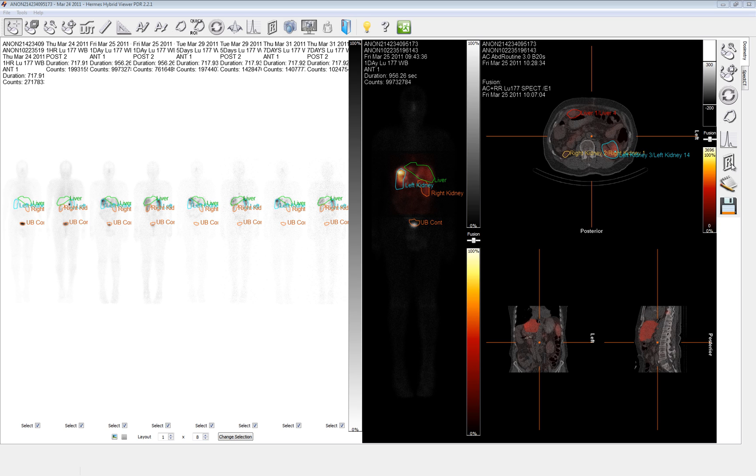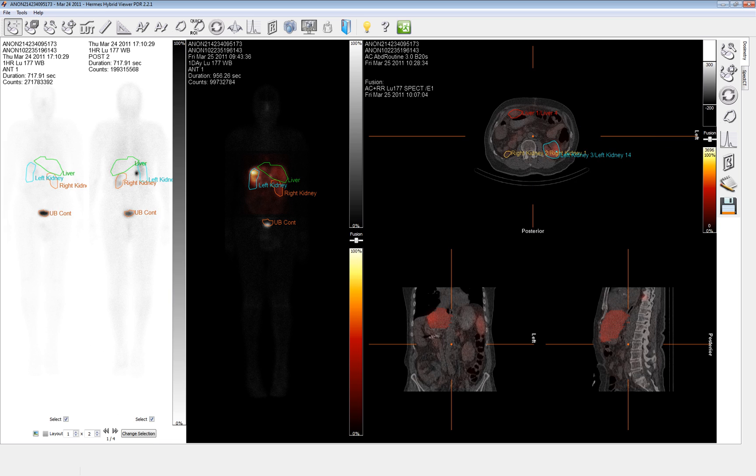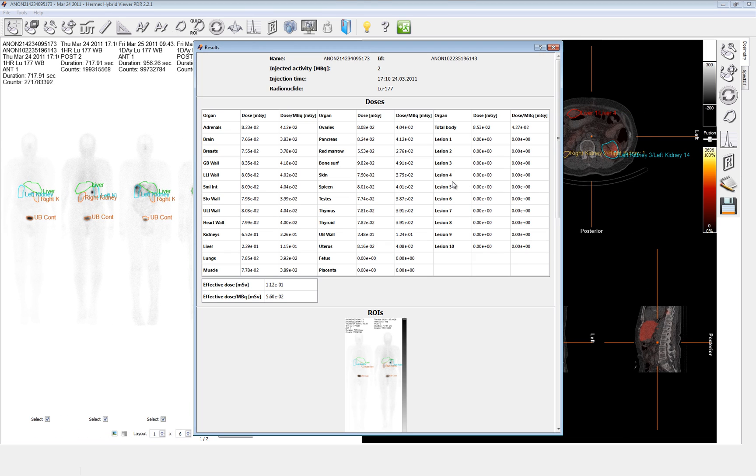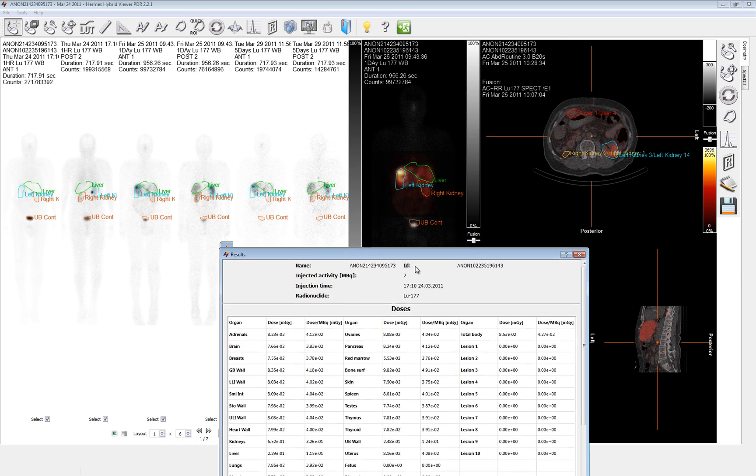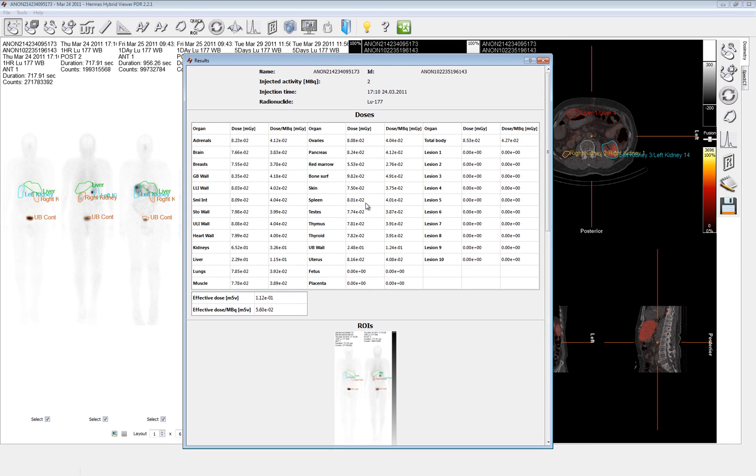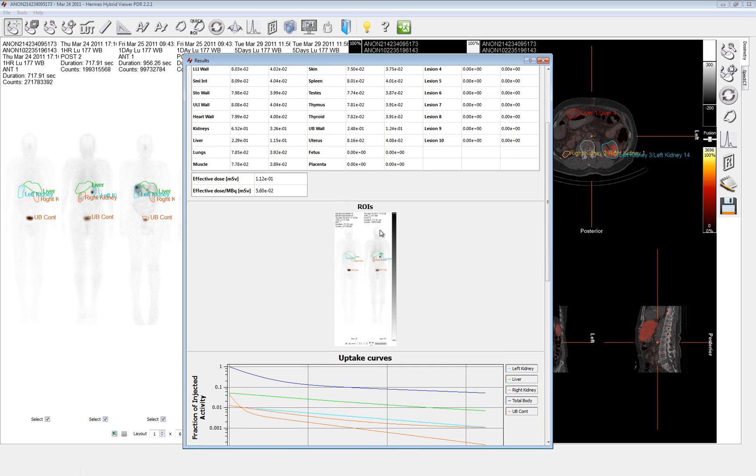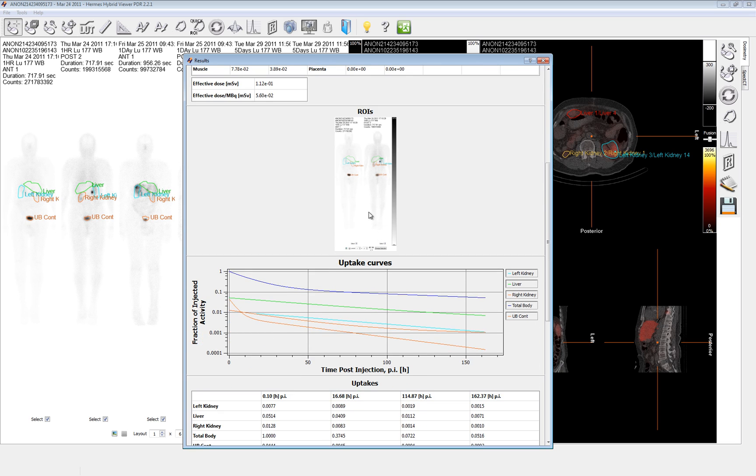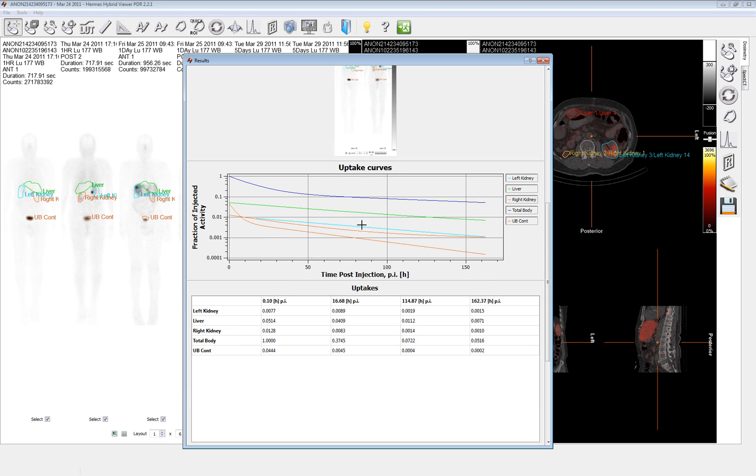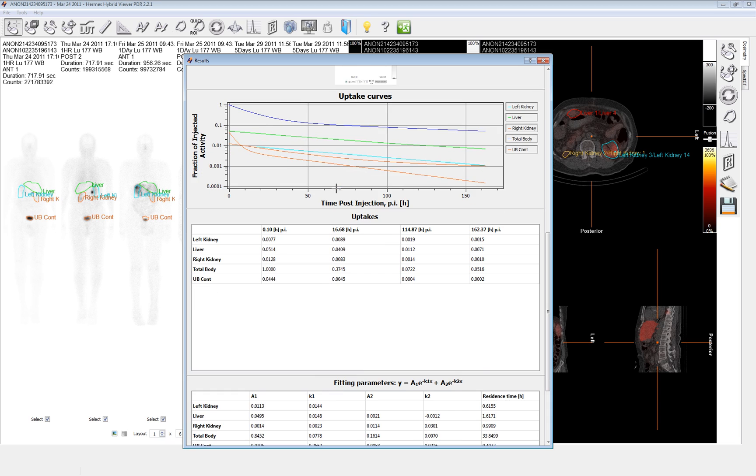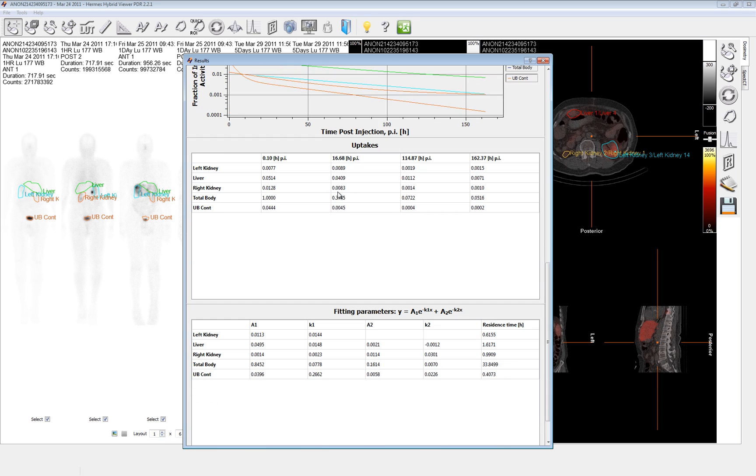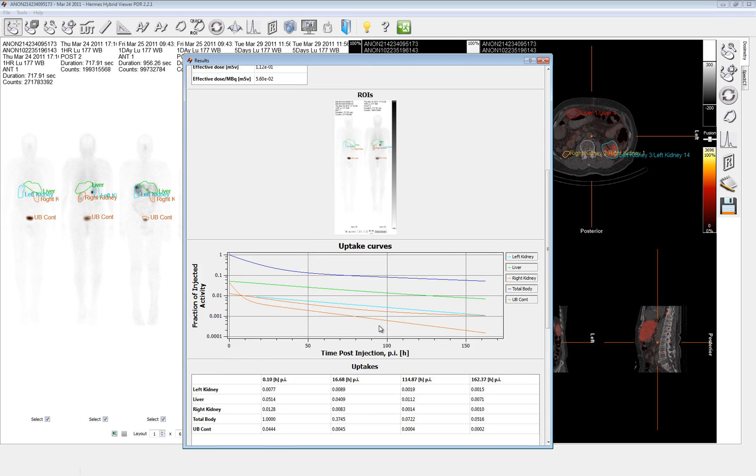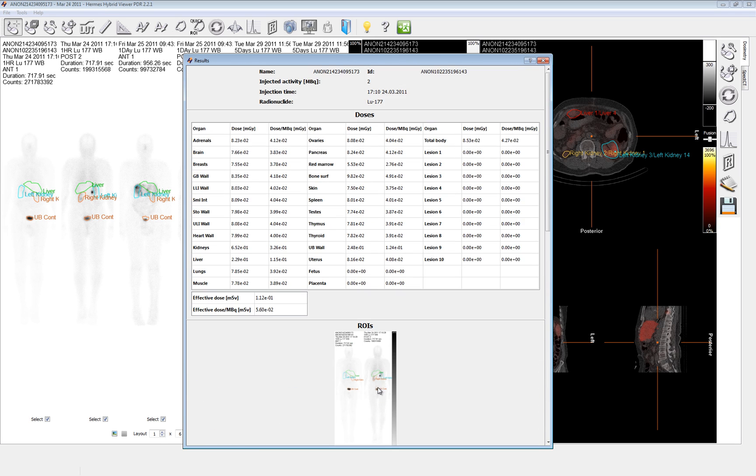And we have our results. Talking about them really quick, we'll click that button. It'll open our page, plus also reformat the images on this page to make for a better screen capture. In the results, we have our effective dose, and for each organ, a dose that was received. There's a quick drawing of the ROI on one of the images, all meant for screen captures and sent to PACS as a permanent record. We've got all of the curves fit for all of the different regions. We've got the time for post-activity injection, the amount in the given organs, and finally, the fitting parameters.